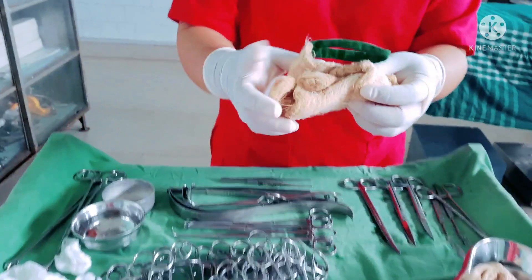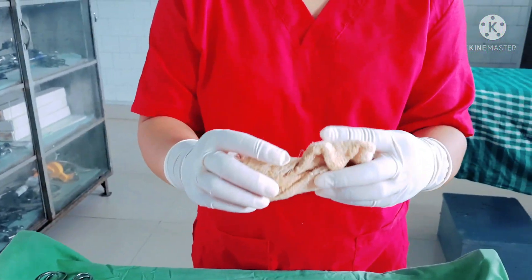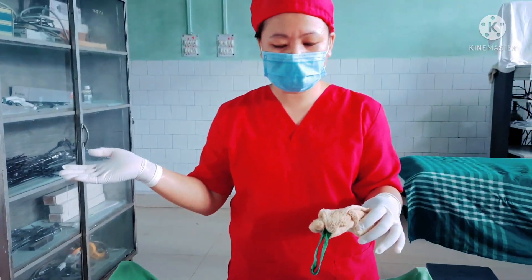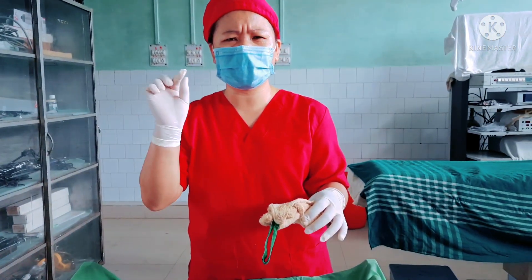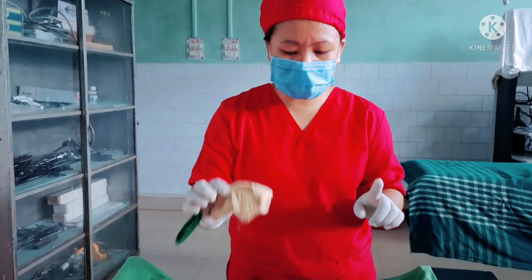We have here one mop or pad, only one, because in appendectomy we only use one. It is quite sufficient because it is a small opening and we use one pad here which is small in size.